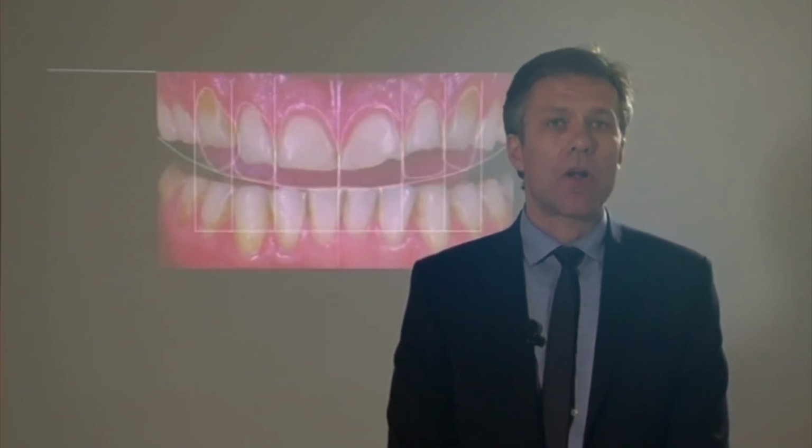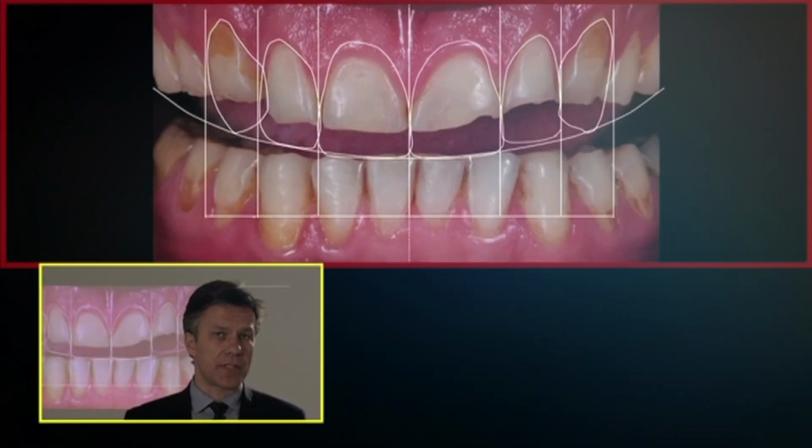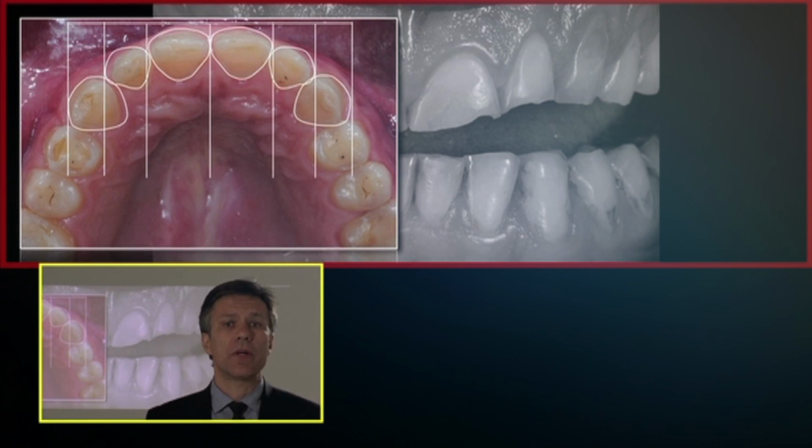So these are the drawings that I do to help us determine the proper smile design. This will guide my technician to do the wax-up. We can see different views, the buccal view and the occlusal view. How can we work with that?